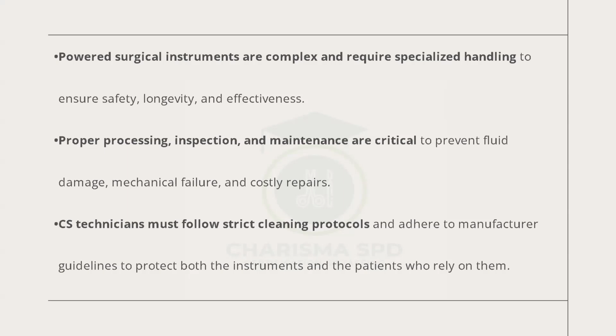If you don't follow the right instruction or the right way of doing it, you are going to damage the handpiece, whether electrical, pneumatic, or battery powered. We cannot overemphasize that. We have mentioned it several times. Fluid invasion, lubricating, checking for cracks, checking for nicks, and all of that will prolong the lifespan of the instrument.